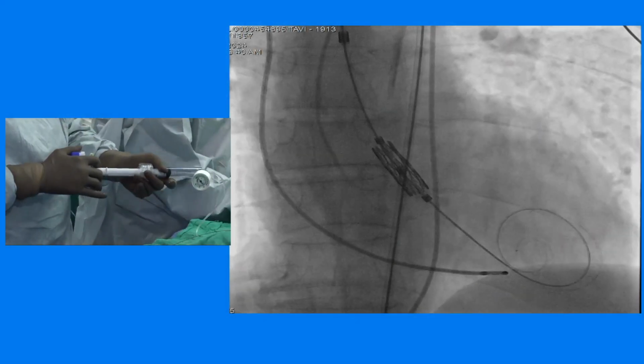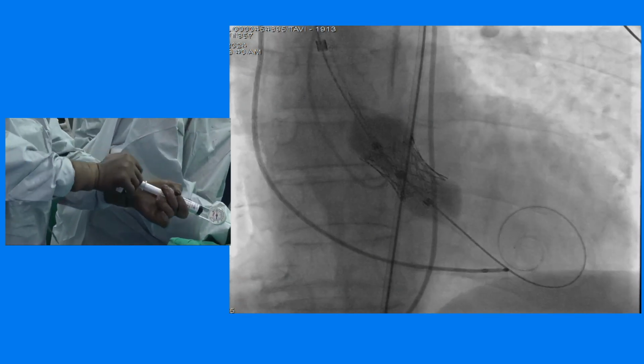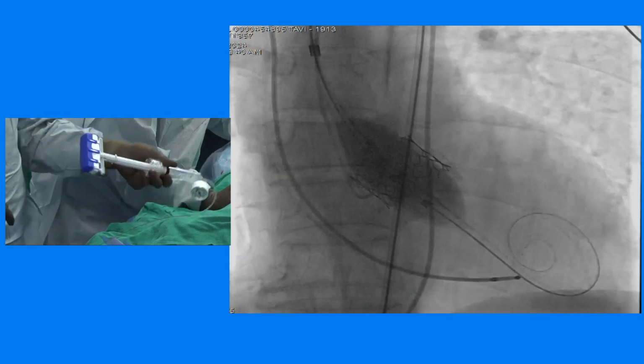220. Pressure is going down. Ready. Ready. It is below 40. Pressure is below 40. Yeah, going. 3, 4, 5. Down. Disconnect.